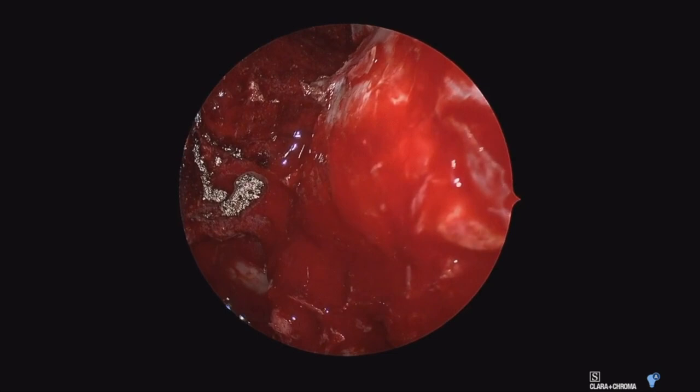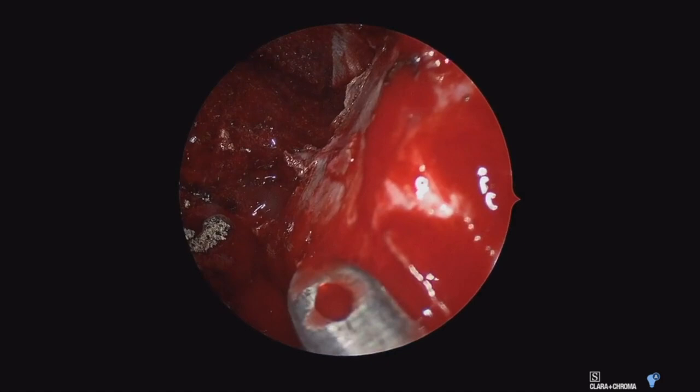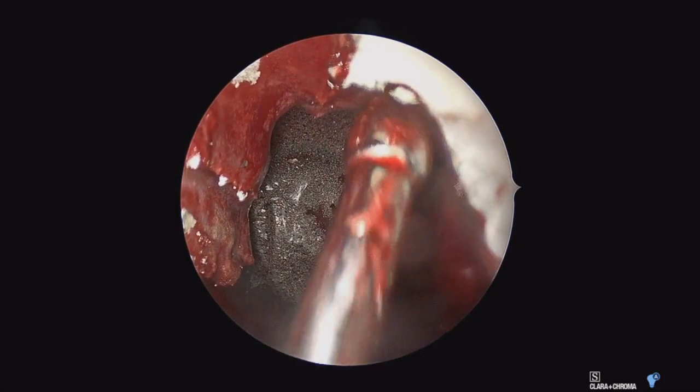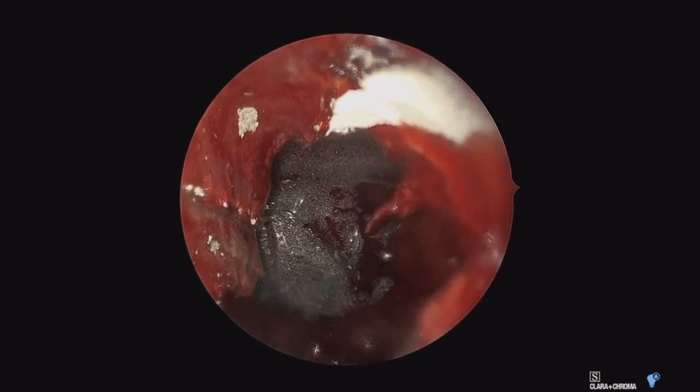I like to maintain that plane right along the periorbita to make sure the fat stays intact and the biopsy does not inadvertently involve the medial rectus. The periorbita was free of tumor in this case. In cases where the tumor abuts the nasal lacrimal duct system, I think it's prudent to drill down the entirety of that lacrimal system and then sample the lacrimal sac and soft tissue contents to ensure it's not involved with tumor.